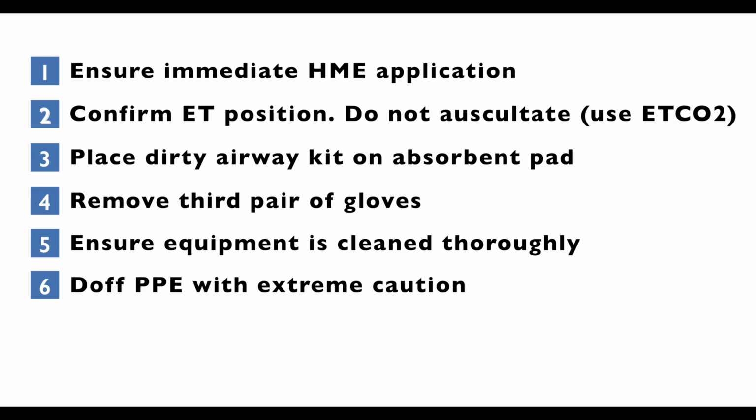Doff PPE with extreme caution. Make sure you go one at a time and use a buddy system. It's important to be aware of space in the room and make sure that you do not contaminate yourself or others.